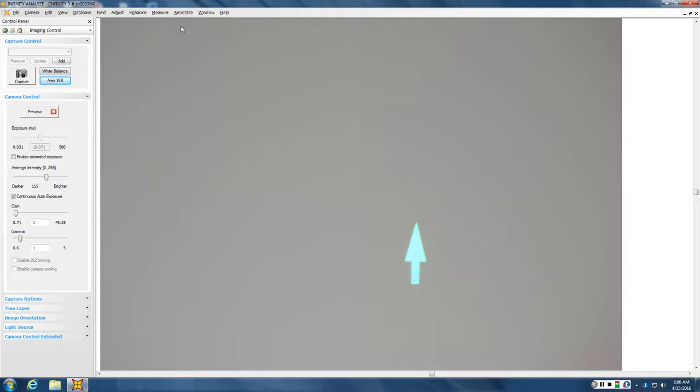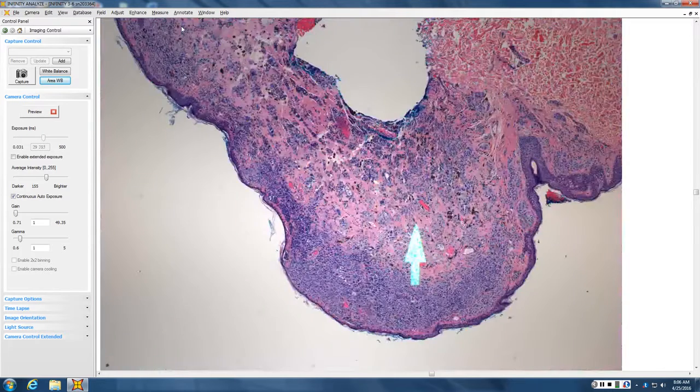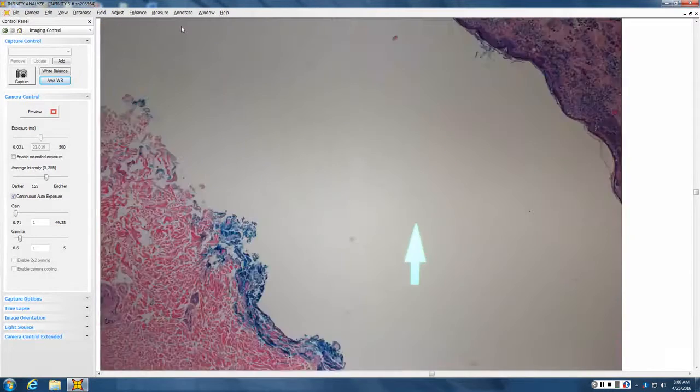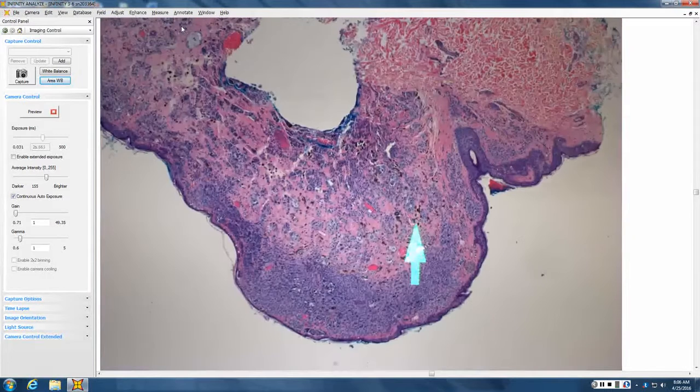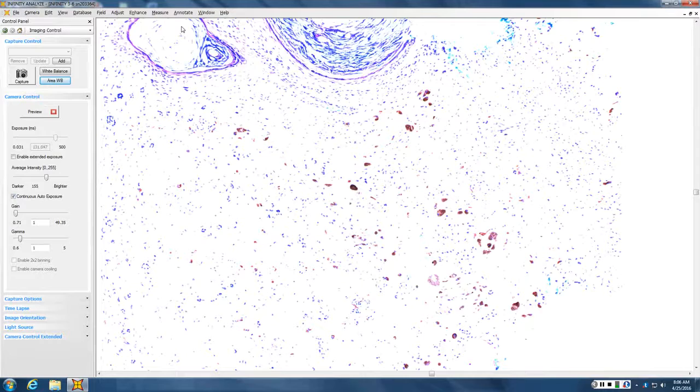Okay, let us use the remaining time to do a little rapid fire potpourri because we've hit the basic patterns that we need for that. Okay, so we're going to go kind of rapid fire. So, Ashley, you want to start us out?